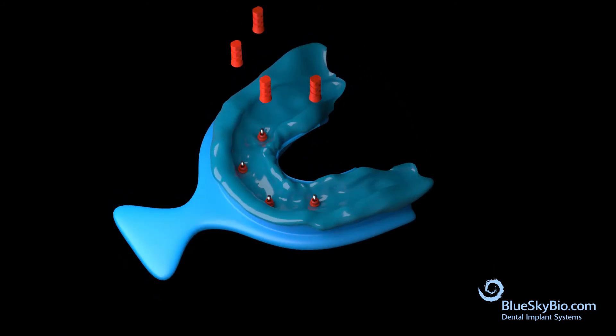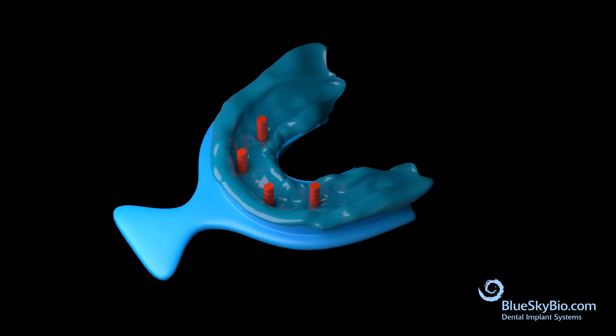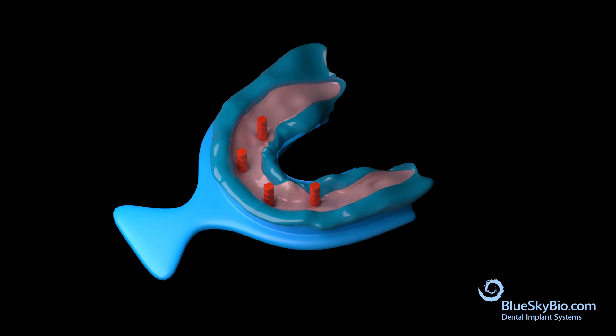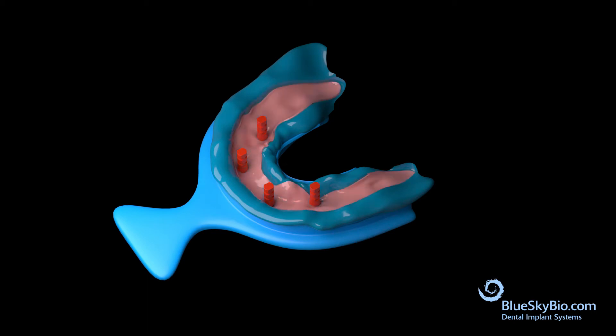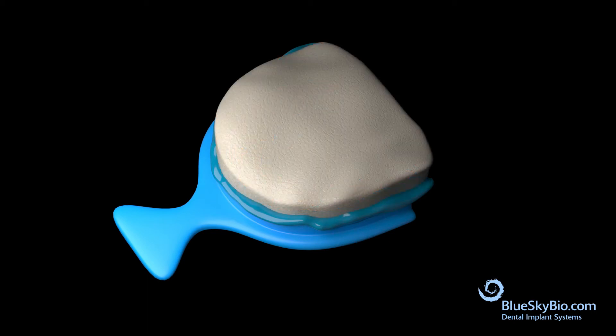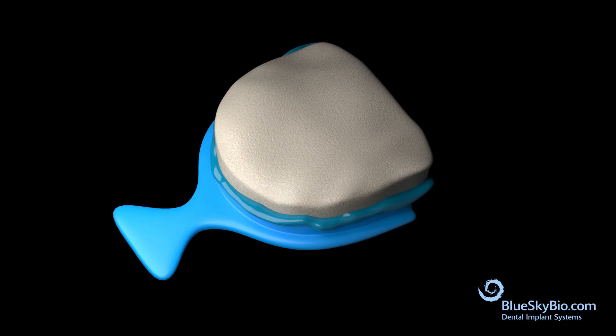Implant analogs are placed into the impression. Apply gingival material to the impression. Pour stone in the impression and create the stone model.